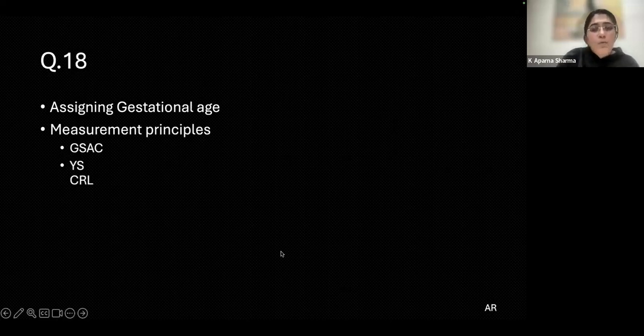Yes, and I think people who are doing this scan have the responsibility to document it absolutely correctly, because later on there is so much confusion regarding this, that even a previously documented dichorionic pregnancy presents with features of TTTS. So we regularly face these problems. So it is the responsibility of people doing the scan at this gestation to save those images so that they can be referred to later.